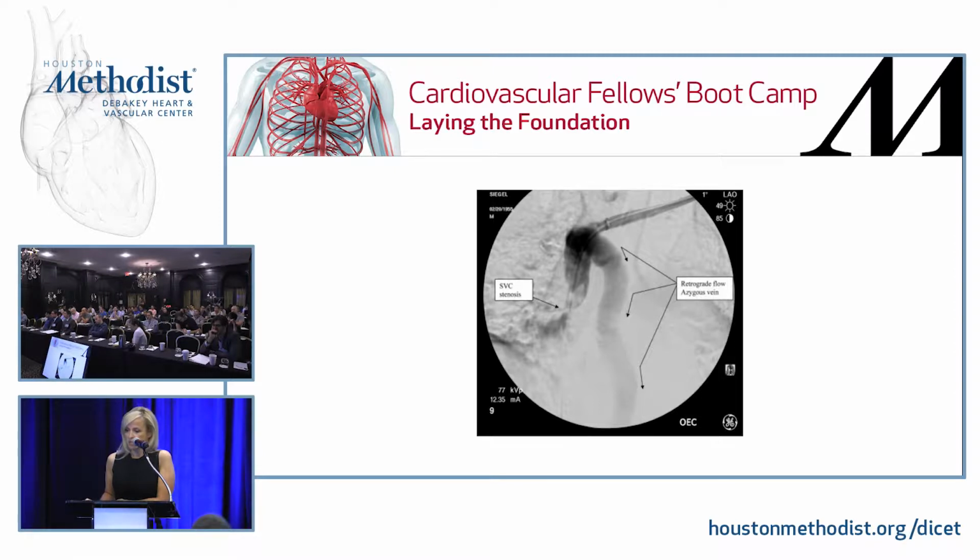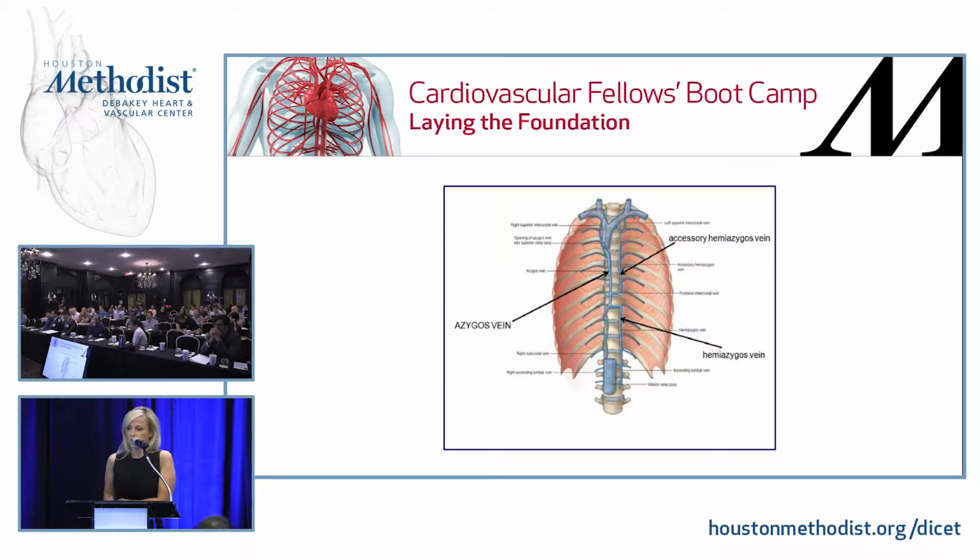So this is something where you can see that this would be easily mistaken for an SVC. So you have to be aware of your anatomy in order to understand what it is you're looking for.